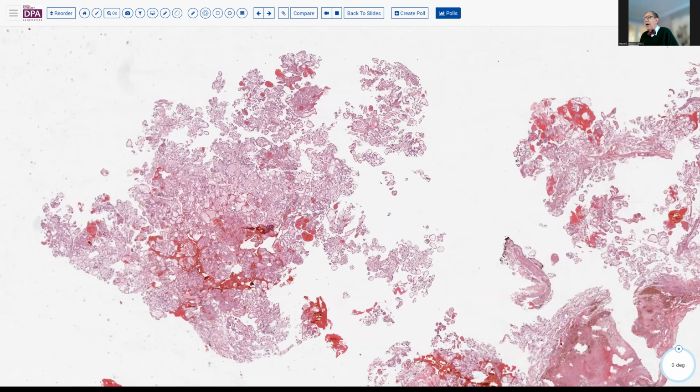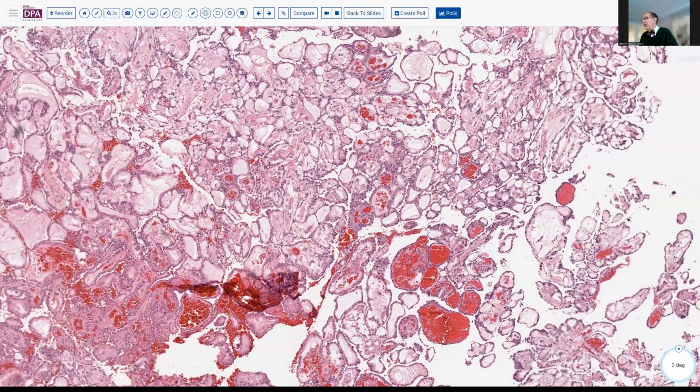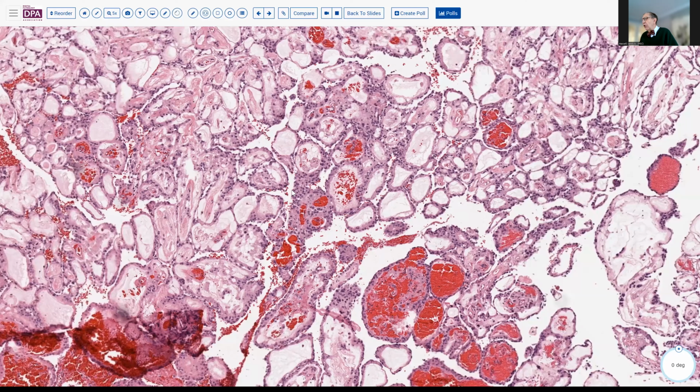meninges here. And as we look at this lesion, we can see an interesting array of tissues. There's sort of this central myxoid tissue, and then a peripheral degree of maybe epithelial or epithelioid type cells around the periphery. Not all of these little spaces have a vessel. Some do, as you can see here, and sometimes these are a little bit hemorrhagic, but not all of them have a vascular core.